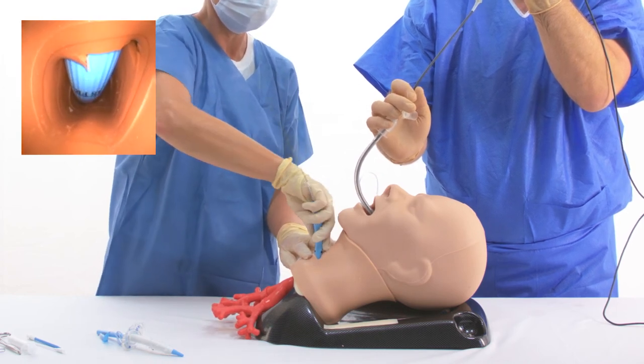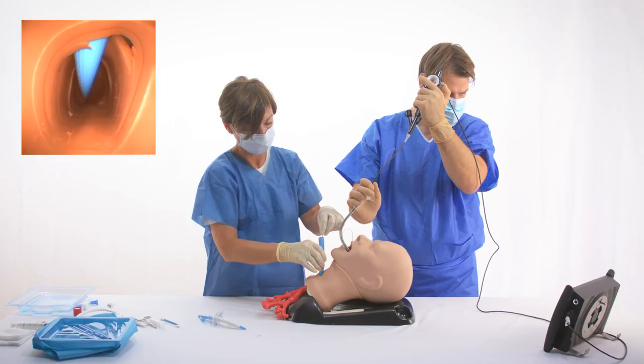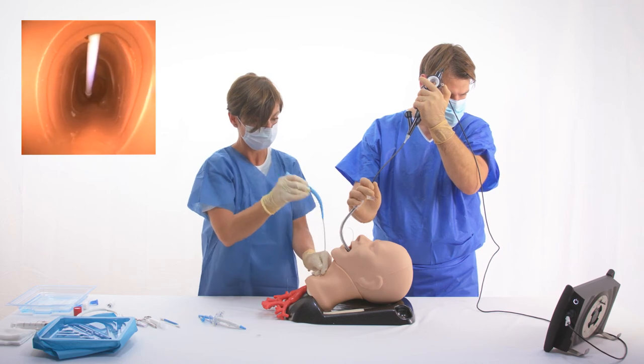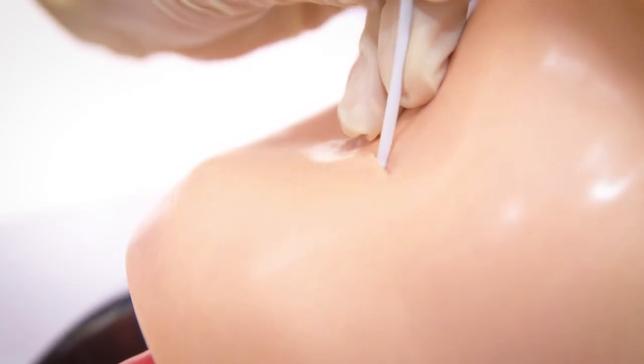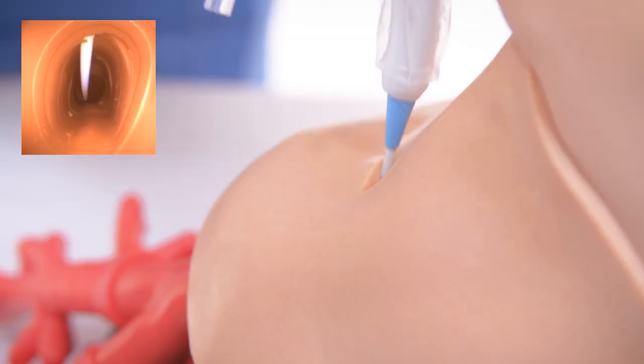Bronchoscopic guidance may prevent possible trauma to the posterior tracheal wall. The dilator is removed while keeping the wire guide and guiding catheter in place. Then the tracheostomy tube is introduced with its loading dilator to its flange.